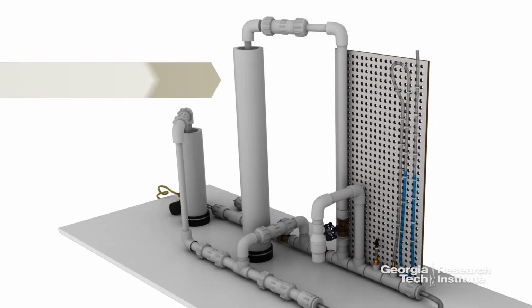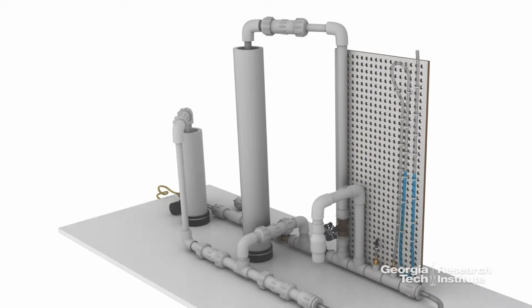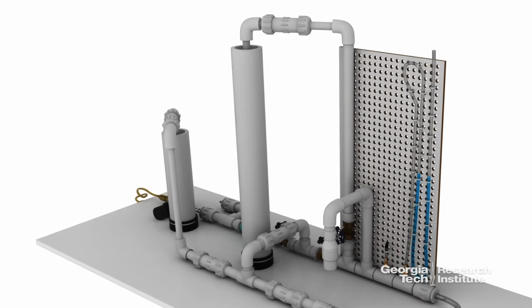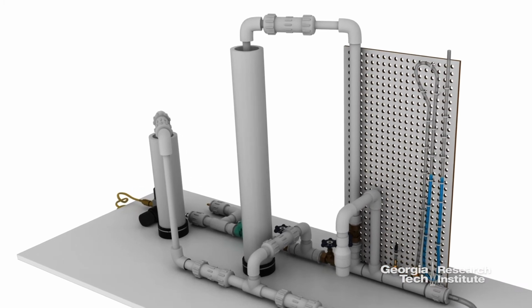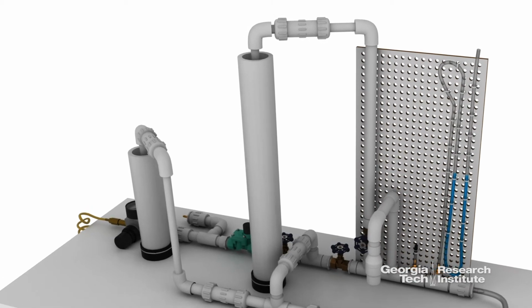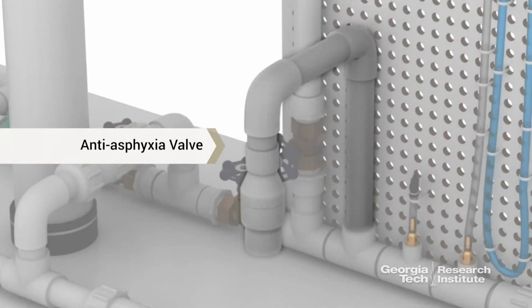This is the PIP valve. This tube goes down into a column of water, and you set the PIP pressure by adjusting the water height. This also is a safety valve, so if you ever had a severe overpressure in the system, it can't exceed whatever you have this set to, because the air will just blow off through this valve. This is the anti-asphyxiation valve, which is essentially a check valve.